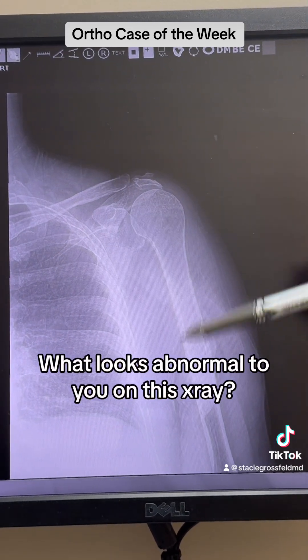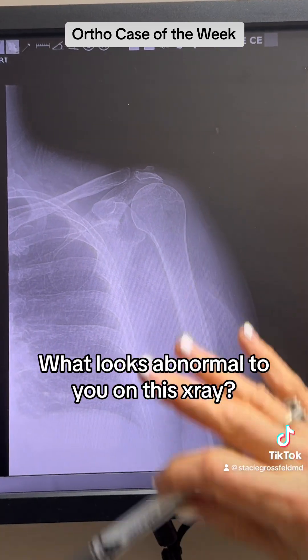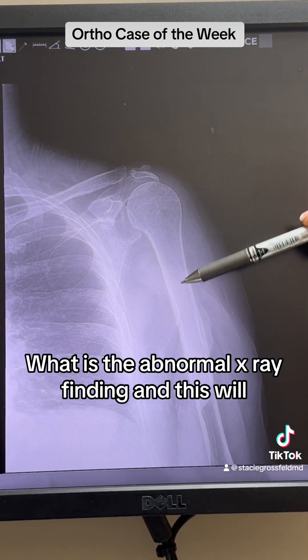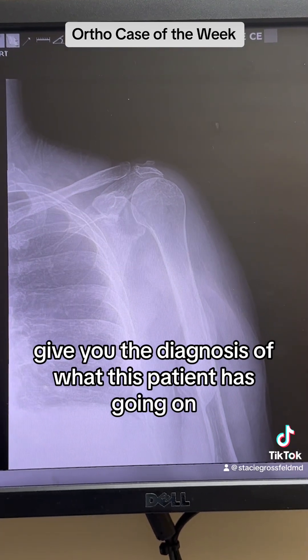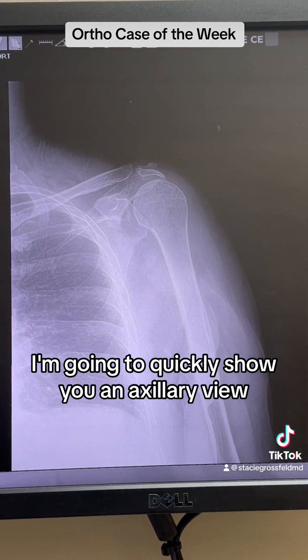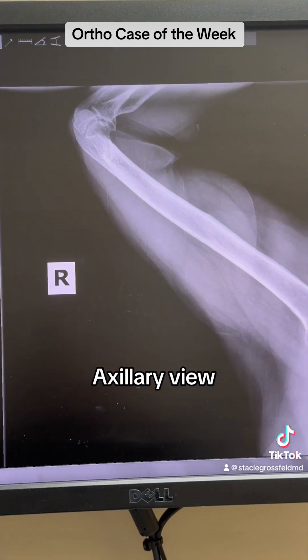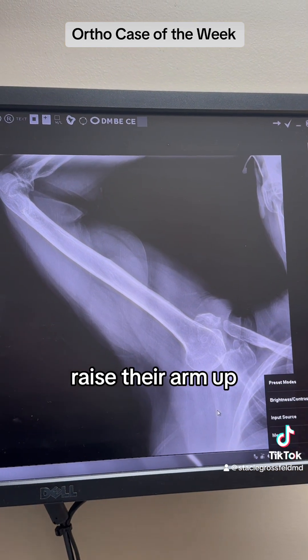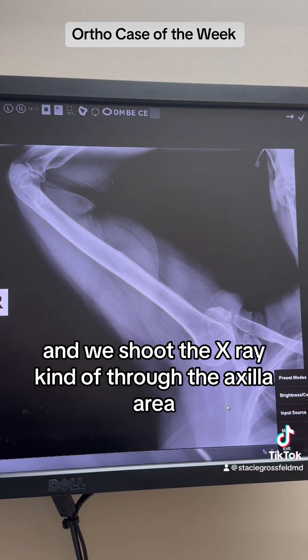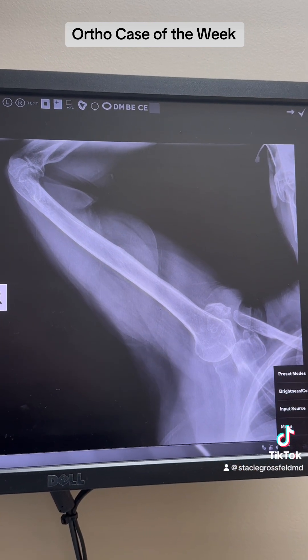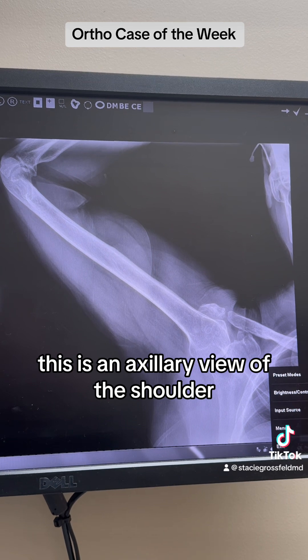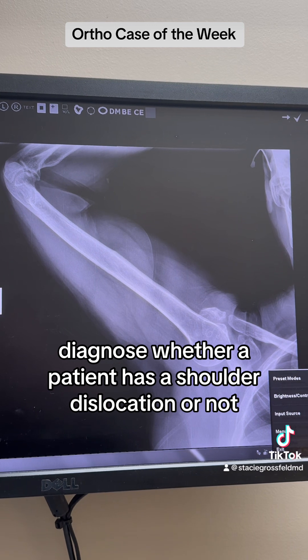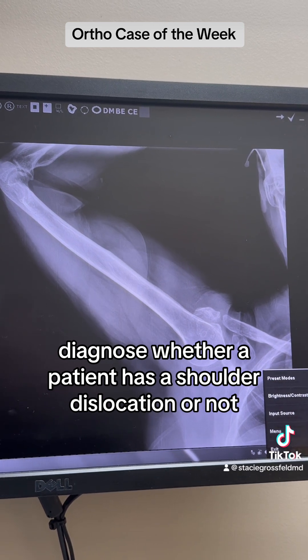So what looks abnormal to you on this x-ray, and does the abnormal x-ray finding give you the diagnosis of what this patient has? I'm going to quickly show you an axillary view. The axillary view is when we have the patient raise their arm up and we shoot the x-ray through the axilla area. It's really good for diagnosing whether a patient has a shoulder dislocation or not.